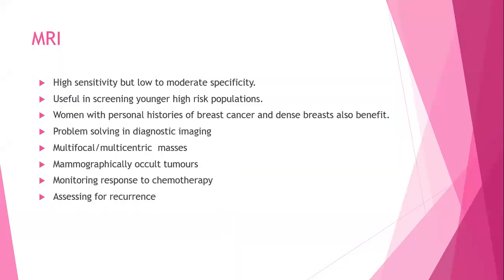We will move to MRI. It's a modality that is also very useful in breast imaging, especially in younger patients who have increased breast density.